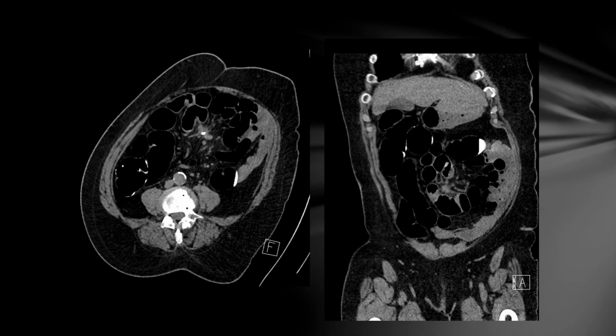In this case, the patient happened to have had gas from their colon go backwards into their small bowel as part of this study, and showed the small intestinal tumour here, adjacent to the mesenteric mass. But you can see when there's all of these bowel loops lying in front of that, that's going to be really difficult to biopsy without doing an operation, essentially, which is quite invasive.